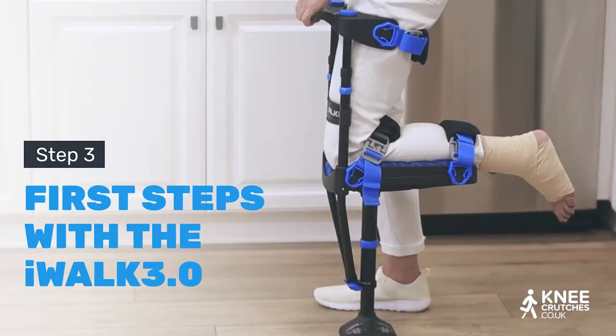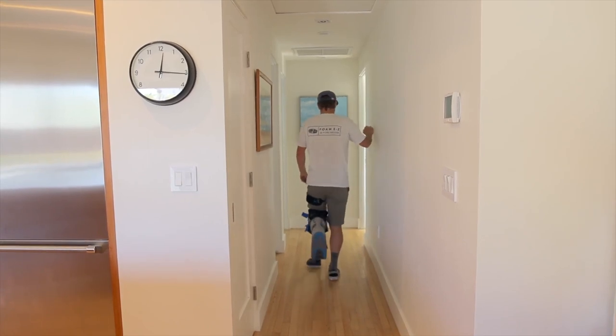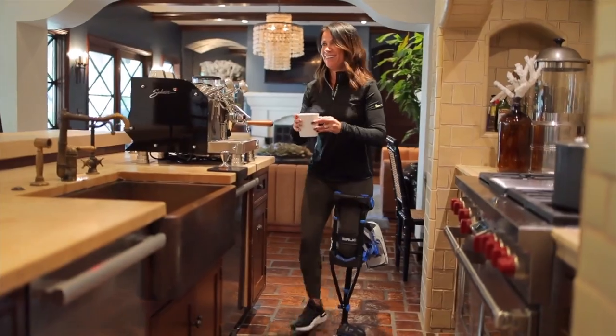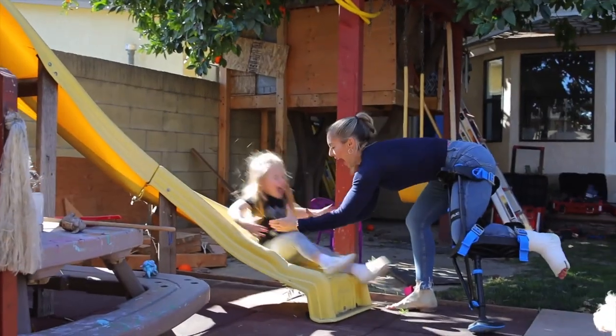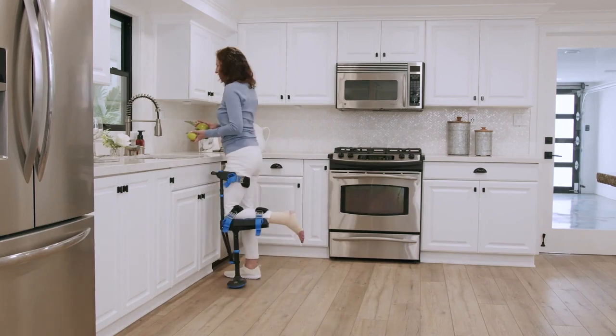Now that you've correctly fitted your iWALK, let's start walking. Walking with your iWALK crutch is easy and intuitive once you learn how. Follow our instructions and soon you'll be walking with confidence and safety. Before you start, let's go over a few prerequisites.